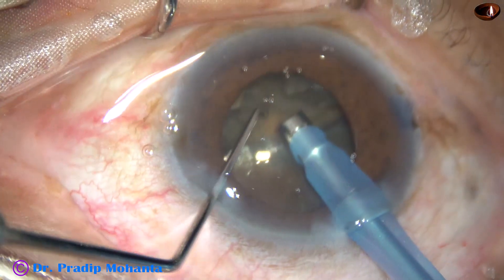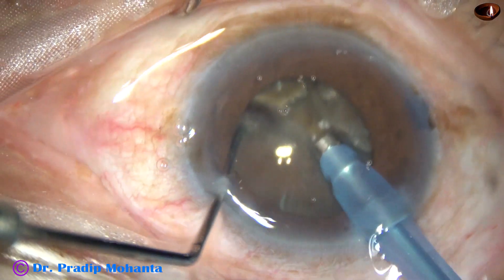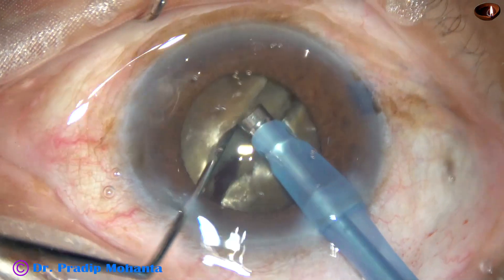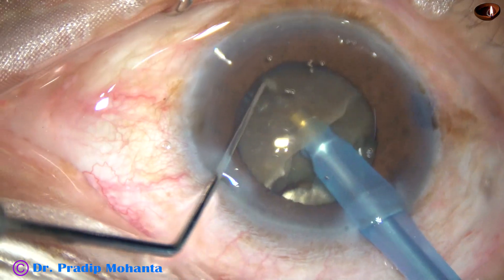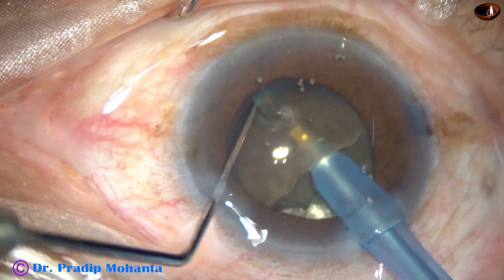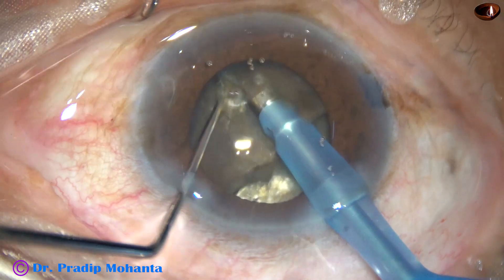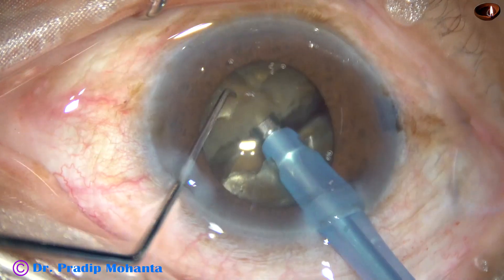I try to tilt this heminucleus and try to get the edge — we could not get it. Going through the substance of the other heminucleus through a deeper plane and getting a nice crack, but again only at the periphery. Could not separate the two fragments completely.